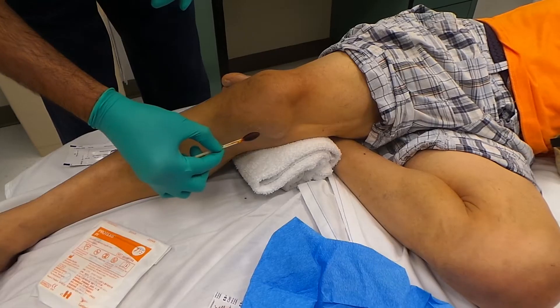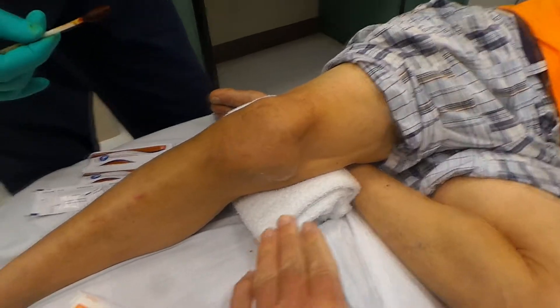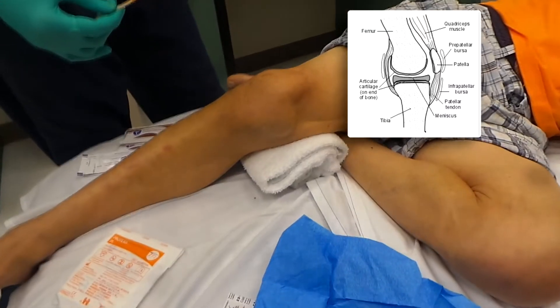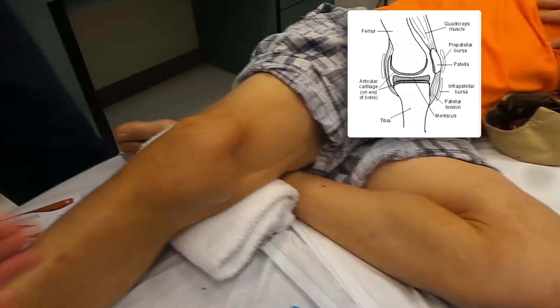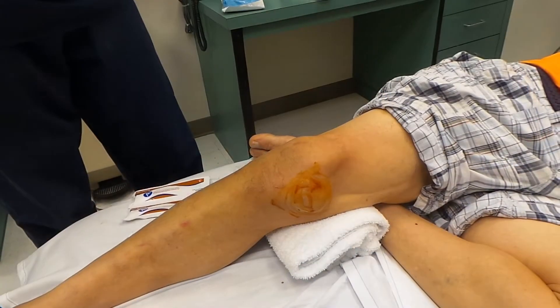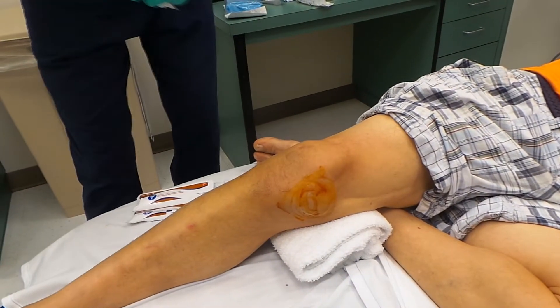We're going to travel with the plane of the fluid. The temptation many times is to go straight in to the bulge, and in the process you compress the fluid level and it diffuses out and sometimes you miss. But if you follow the plane and come in sideways — that's perfect. You can do it blindly, but we'll actually do it by ultrasound.